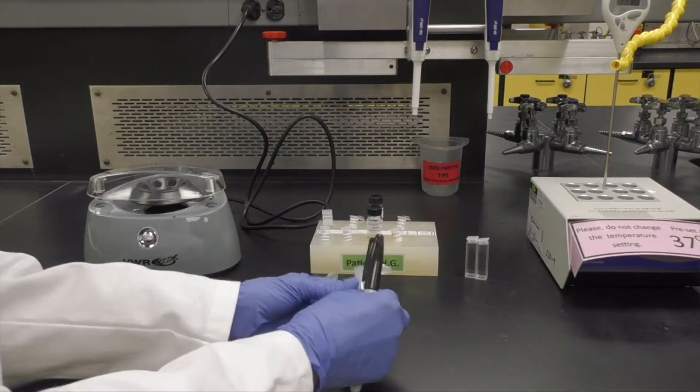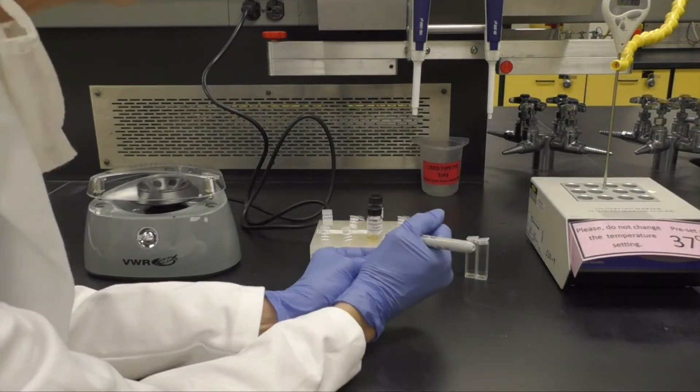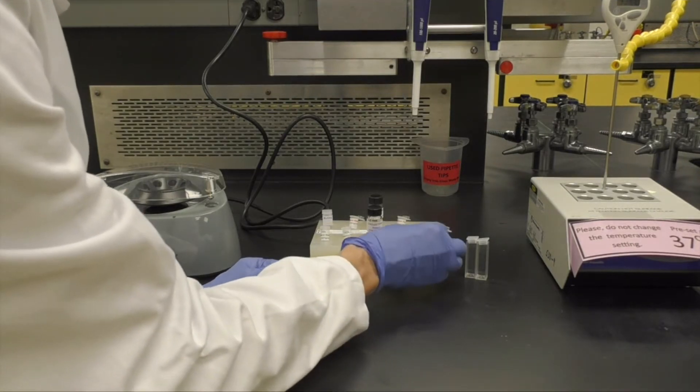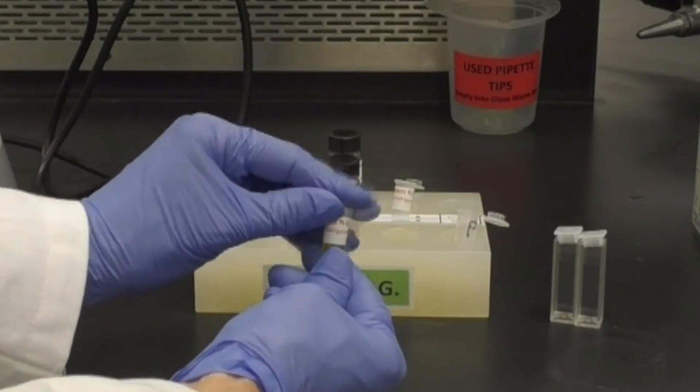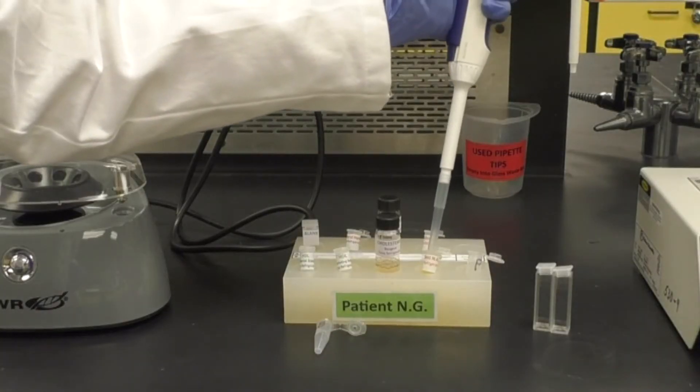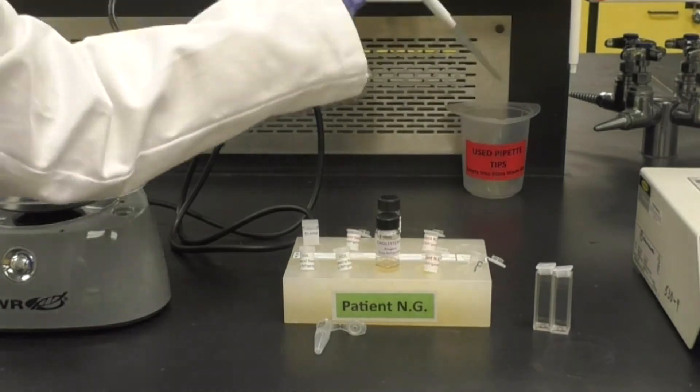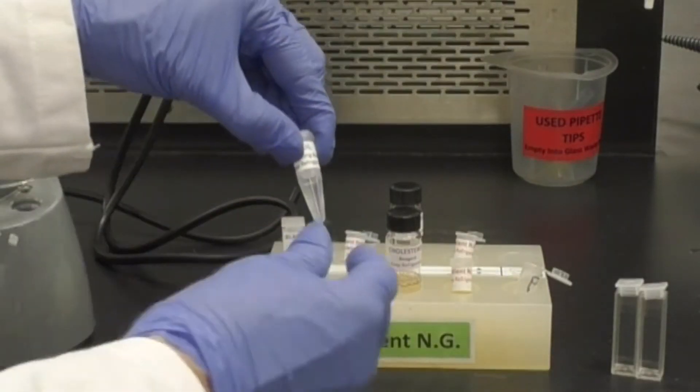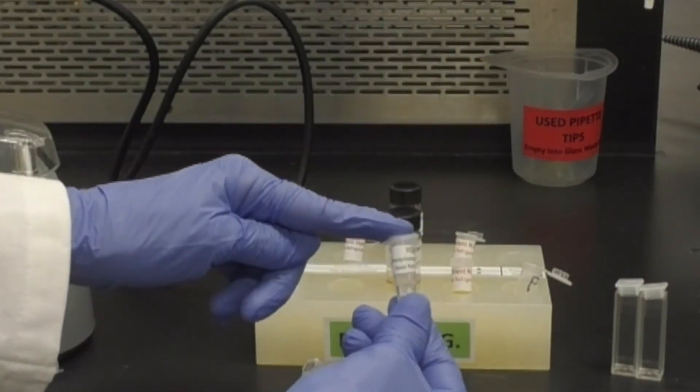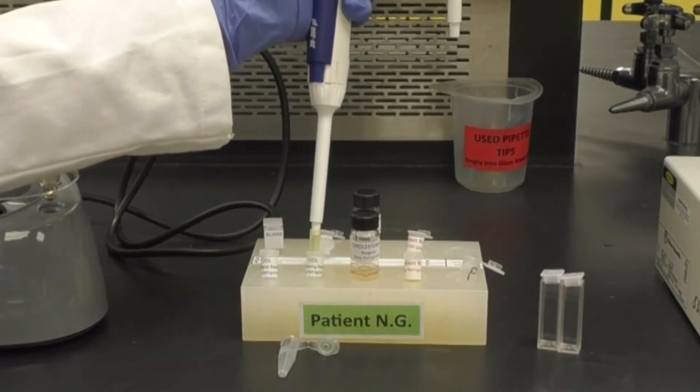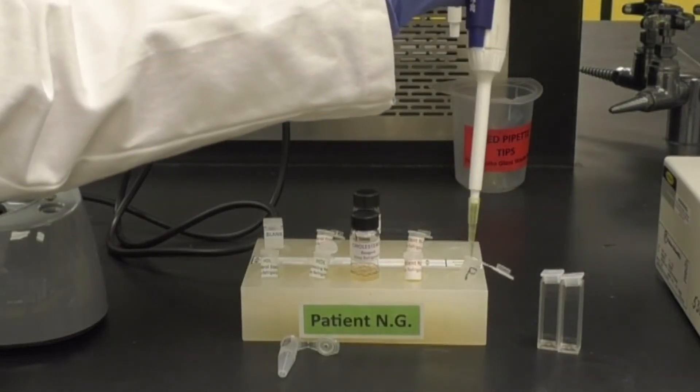To perform the HDL test, start by labeling the microfuge tubes to indicate your patient and balance tube. Add 500 microliters of your patient sample to the patient tube. Then add 50 microliters of HDL precipitating reagent. This reagent will pull out any non-HDL fractions from the patient sample.